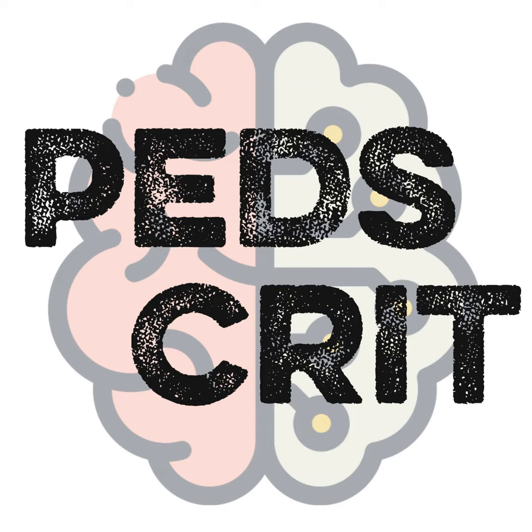So what these people did in this pilot study was to actually try to set their PEEP such that the delta pressure, of measured pressure minus esophageal pressure, was a positive integer. And they ended up using higher levels of PEEP to accomplish that, as you can imagine, in a surgical, somewhat obese adult population. So that generated a lot of interest: are we measuring the wrong thing? Is this prevalent enough of a problem that we should be subtracting this out all the time?